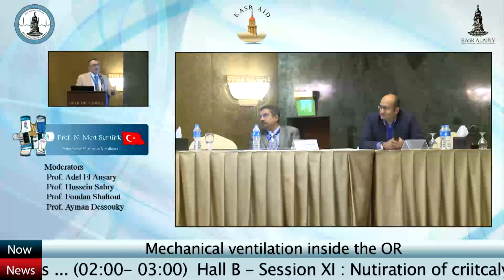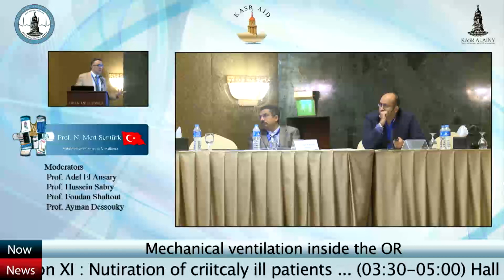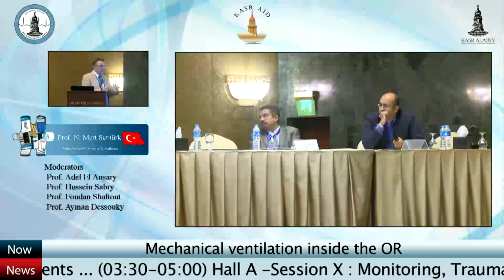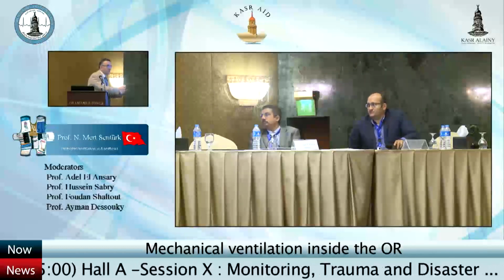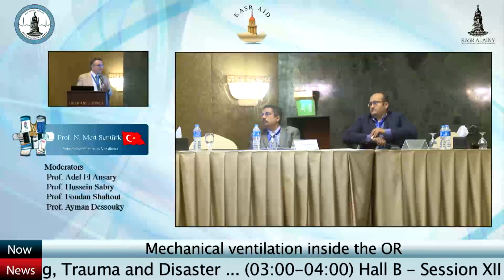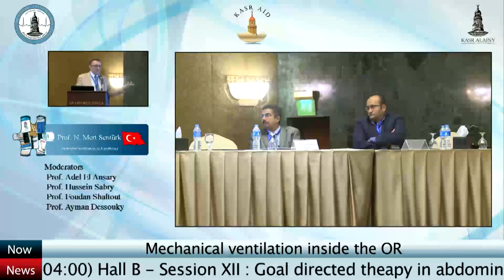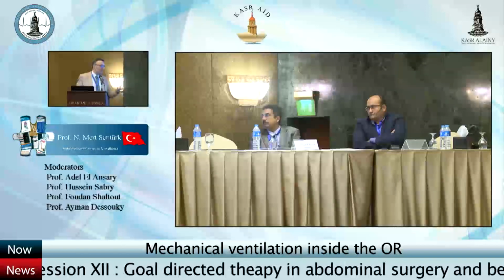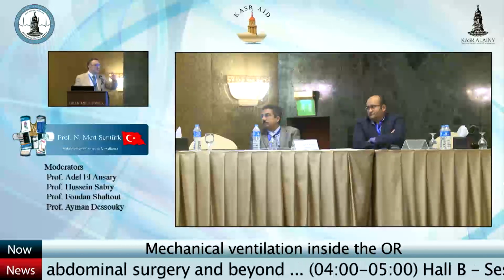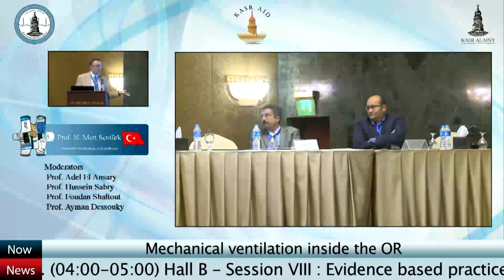Afterwards, in abdominal general surgery, pressure-controlled ventilation cannot be a good idea, because every time the pressure changes in the abdomen, the tidal volume changes too. So it can lead to hyper and hypoventilation. And I'm working in an educational hospital in a faculty. You cannot trust your residents that much that he or she would follow the changes in the ventilation. Therefore, volume-controlled ventilation is a good idea.